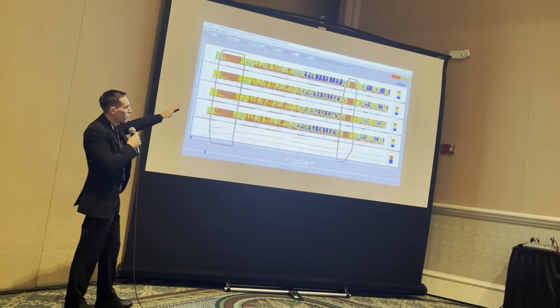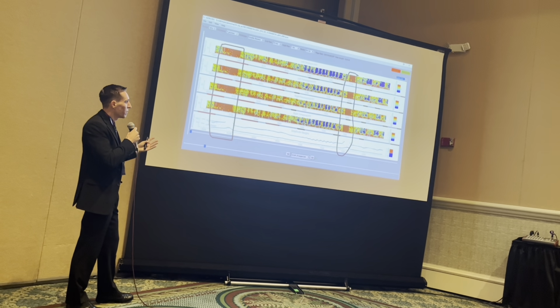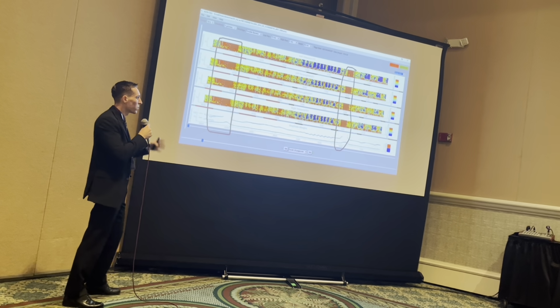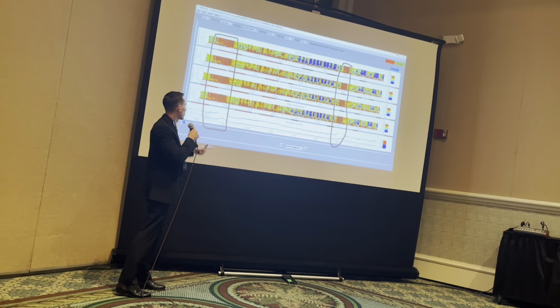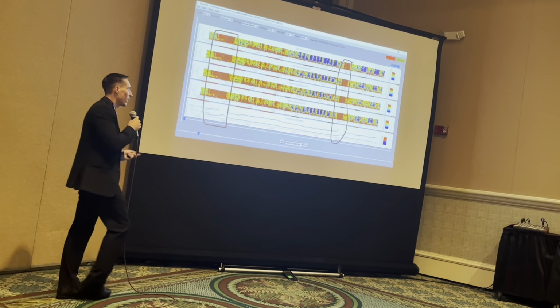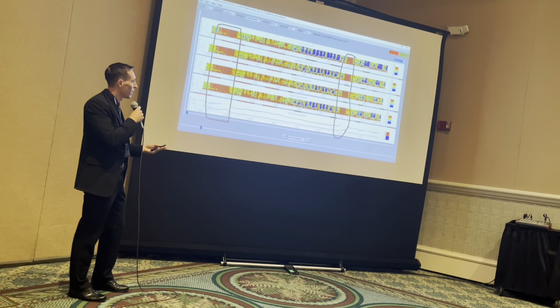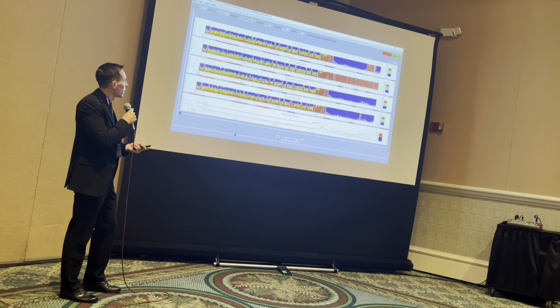So quantitative EEG is not going to tell you everything. You should definitely always look at the original waveforms. It can just help you more quickly get to points of interest, like these two areas here, and the doctor is able to see that, hey, this is just artifact, and this is a psychogenic event and not epileptic.